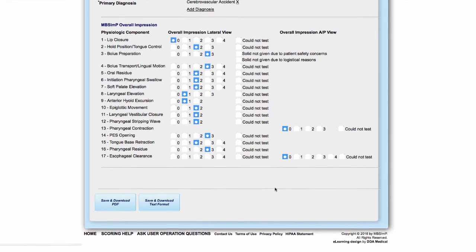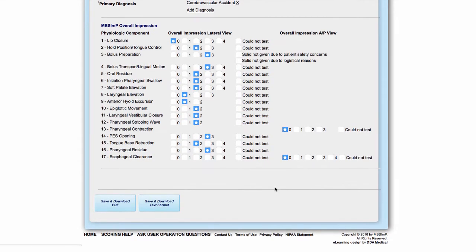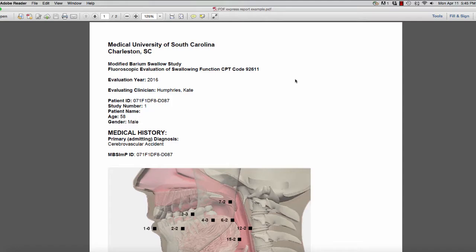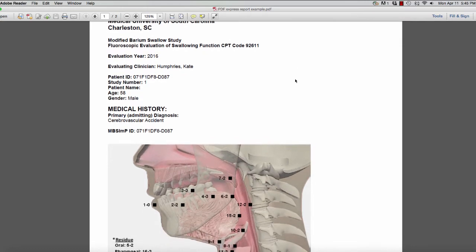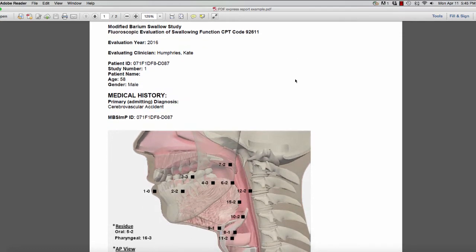There are two options for generating a report. The first of the two reports is formatted as a PDF file that can be downloaded to your computer or tablet.